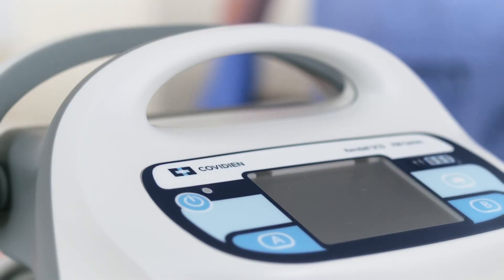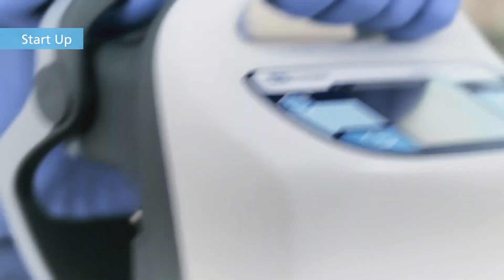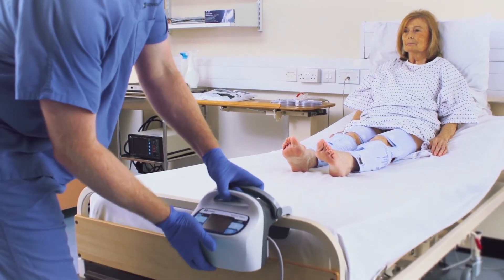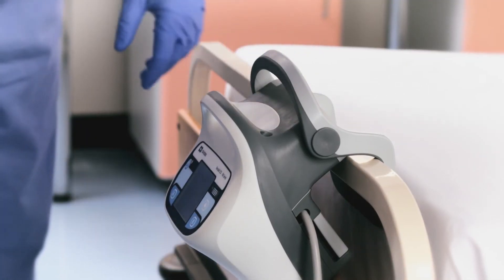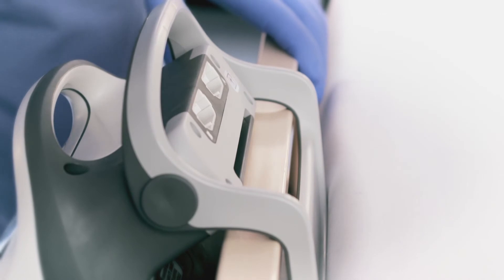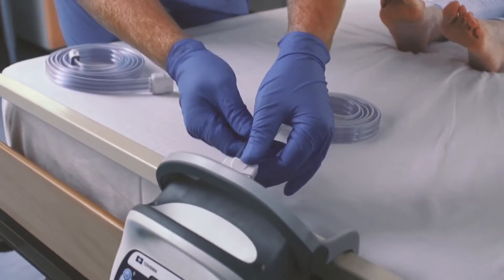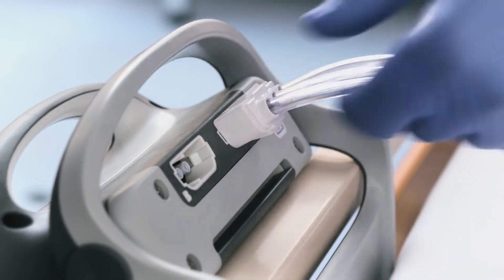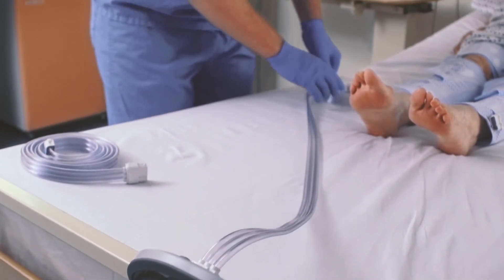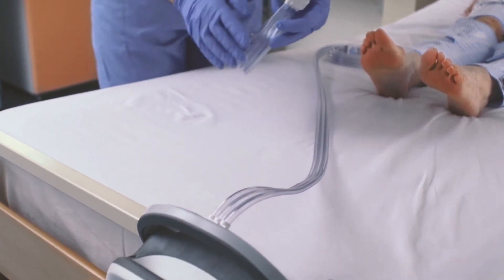Once the sleeves have been placed on the patient's legs, you can prepare the controller. Place the controller on the footboard of the patient's bed, ensuring it is securely fixed and that there is adequate airflow to the vents located at the power cord cover and below the tube set connection points. Plug the tubing sets into the back of the controller, then route the tubing toward the patient's limbs, being careful to leave access ways clear and eliminate tripping hazards.